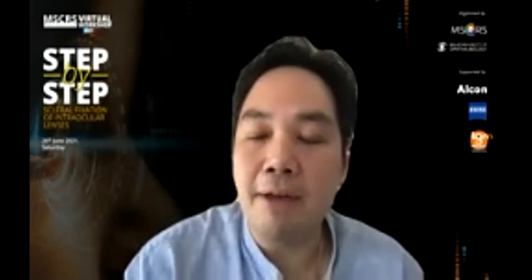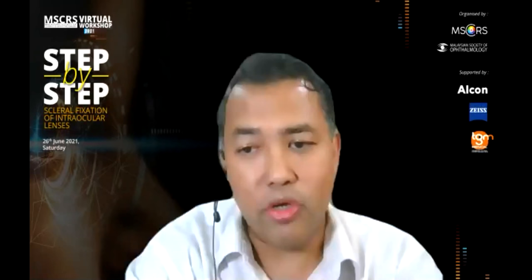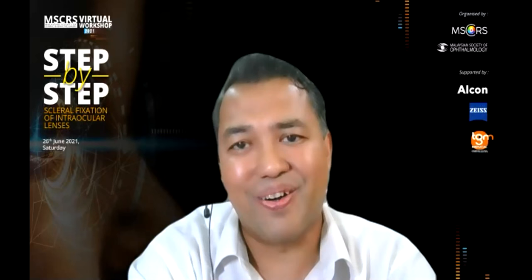A quick comment from maybe each of the panelists, before, you know, there are some questions that have come up. Either we can answer them live or perhaps Noliza, you can type in the answers later. Any comments from the panelists? Just a quick one. A few pointers over there, which Dr. Noliza did very well on. The first one is actually the type of suture. When somebody asks about suture fixation, the first thing I will ask is what kind of suture you have, because that suture will determine a lot on the technique of how you fixate and how you bury.